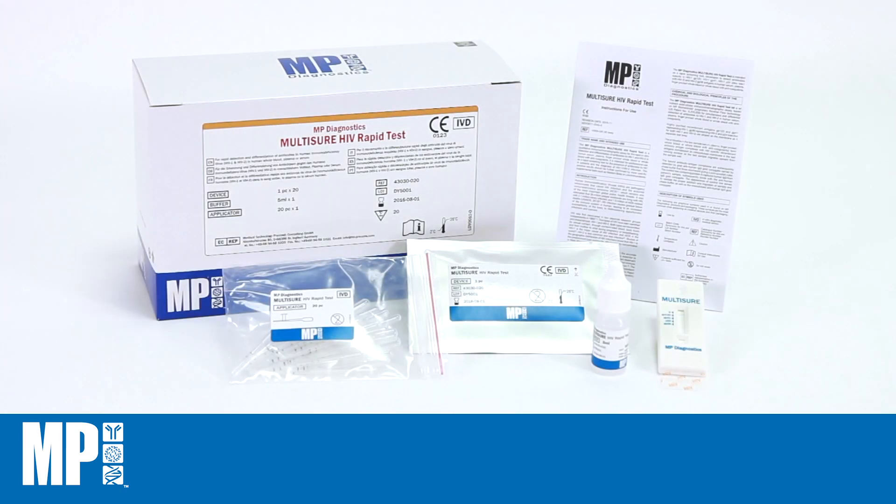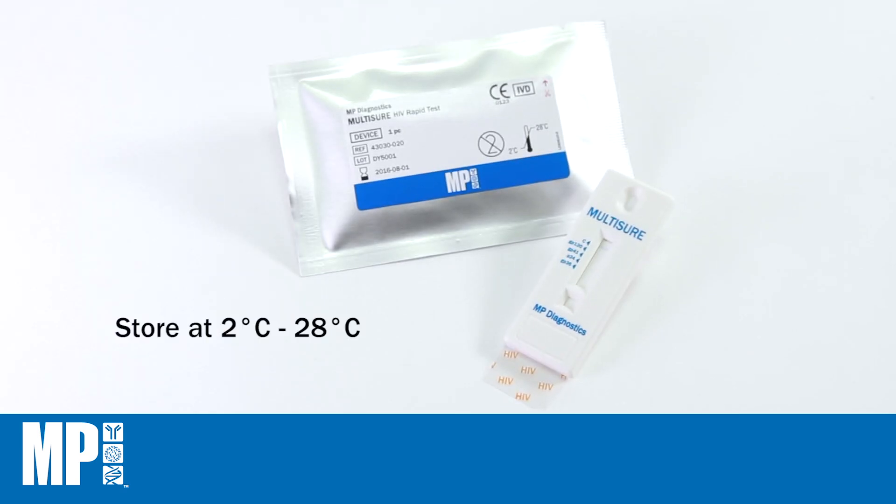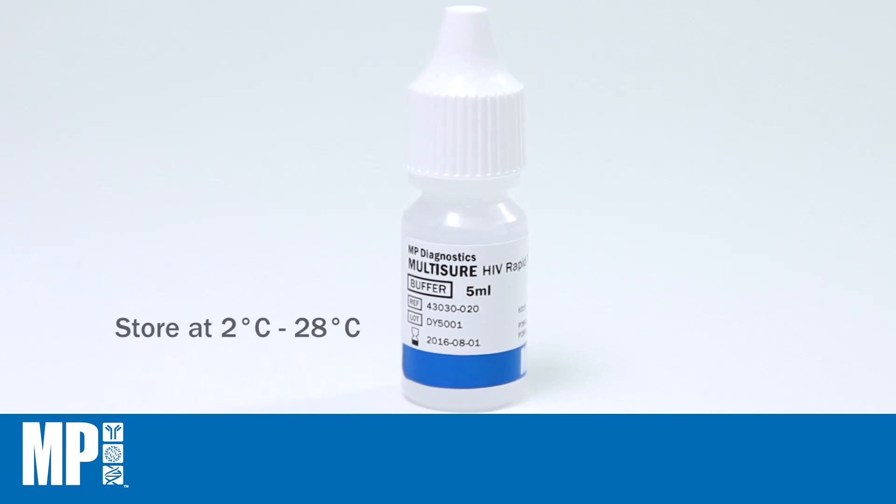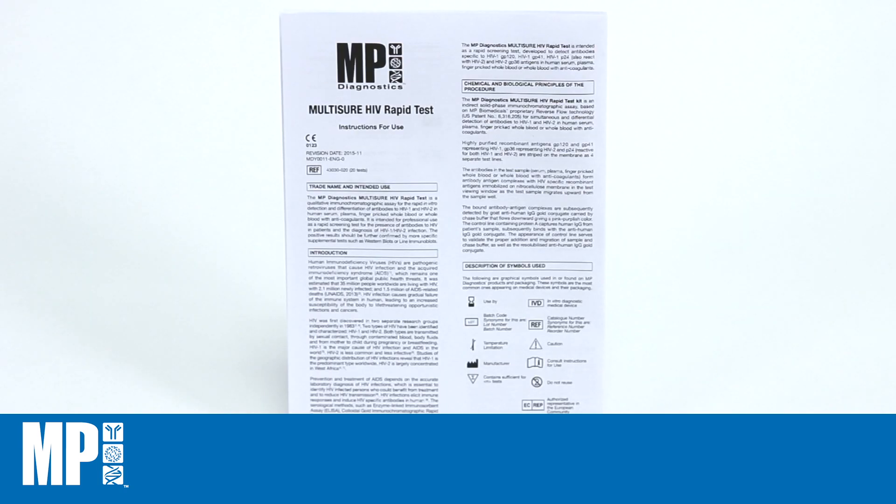Each box contains 20 test devices, 20 sample applicators, a 5-milliliter bottle of Chase Buffer, and instructions for use in six languages.